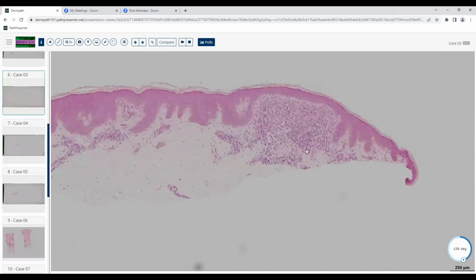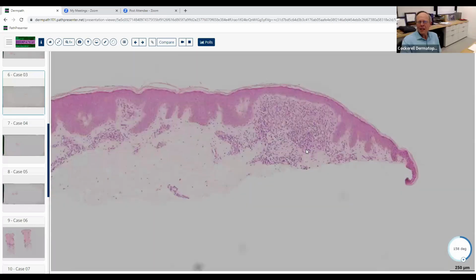There's no surrounding inflammation. It's more of a naked granuloma. Yeah, I agree. There's a little bit of a lymphocytic infiltrate in there. We always talk about sarcoidal granulomas being sort of naked granulomas, but they often will have a little bit of lymphocytes associated with them. It's like they still have at least one article of clothing still on them. So yeah, this has got some lymphocytes in here too, but I agree. It's kind of forming a small nodular aggregation of histiocytes primarily, mostly histiocytes.